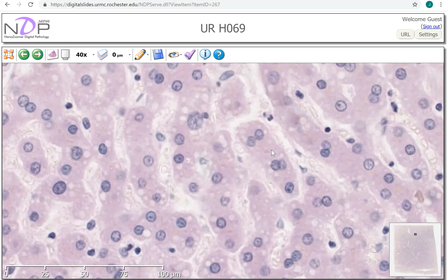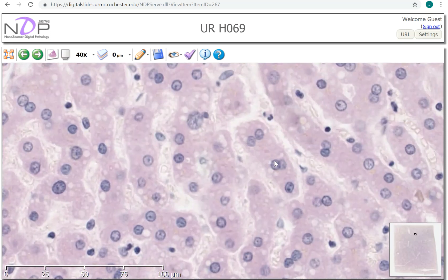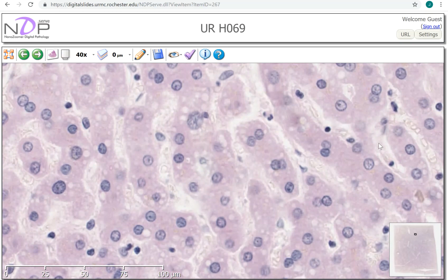As you look around, you may even see hepatocytes that have two nuclei — that's common, especially as a patient gets older. In the sinusoids, you may see red blood cells in them.